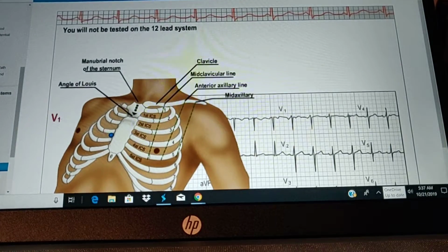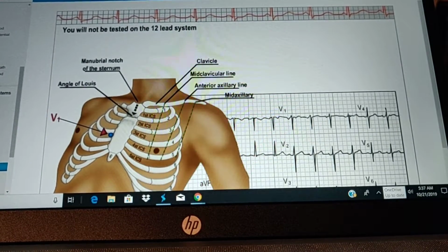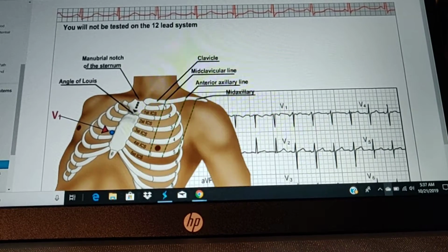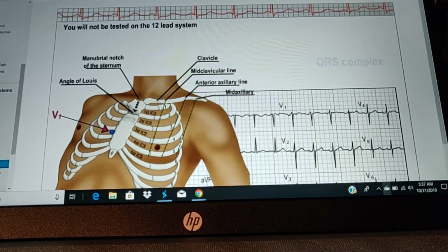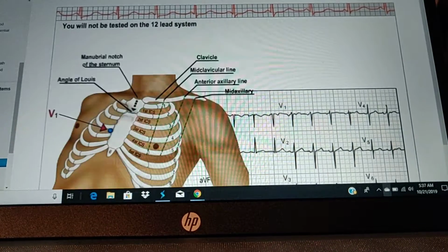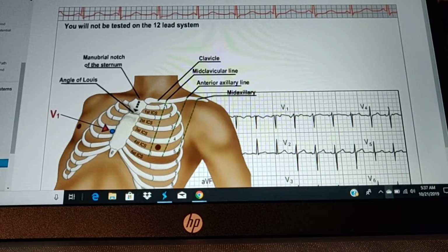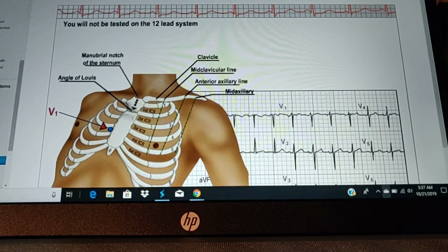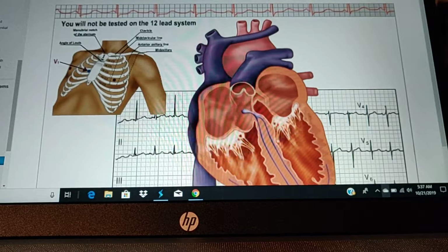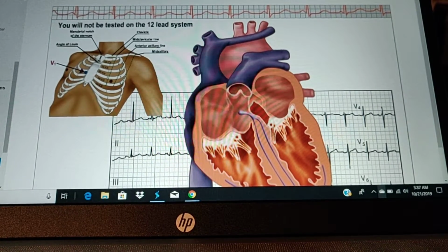The precordial lead corresponds to the modified chest lead MCL1 and shows the P wave, the QRS complex, and the ST segment particularly well. The V1 electrode is placed on the right side of the sternum at the 4th intercostal rib space. This lead helps to distinguish between right and left ventricular ectopic beats.